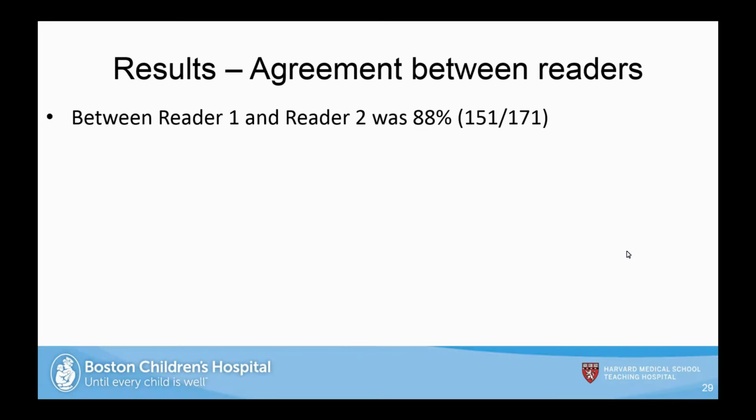I'm wondering if they could put in some borderline cases, instead of just labeling diagnostic and non-diagnostic. If there's any discrepancy between reader one and reader two, then you just say borderline. Then you have a diagnostic and non-diagnostic category and some gray area, where the pathology has some information that this is not so sure. Because the goal is they want to implement it for clinical use, right? So it's definitely saving time no matter what in this case, right?